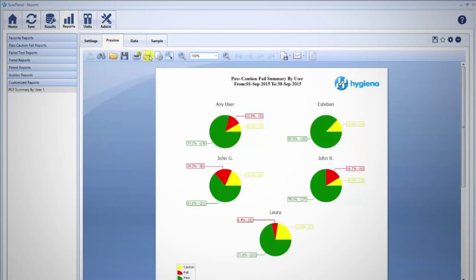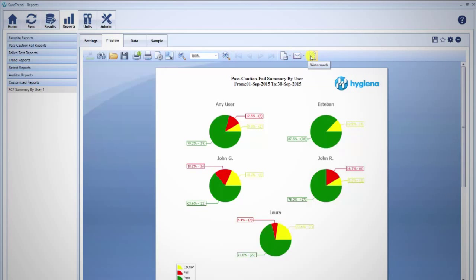Also in the Preview tab, you may print the report, modify the page layout, export or email a PDF of the report, or add a watermark.